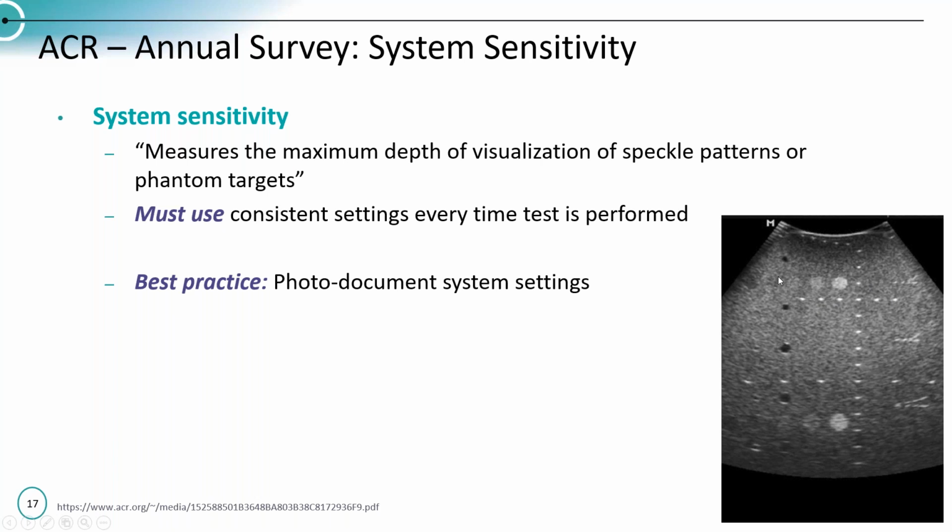You can see this object here. This one has almost disappeared, but we can pull it out. We have another object here, here, and here. But if you look down at the bottom, here's our noise floor, right about here, probably right at about this pin here. Oops, hold on, I advanced my slide by accident. So I would say our noise floor is right about here on this particular image.